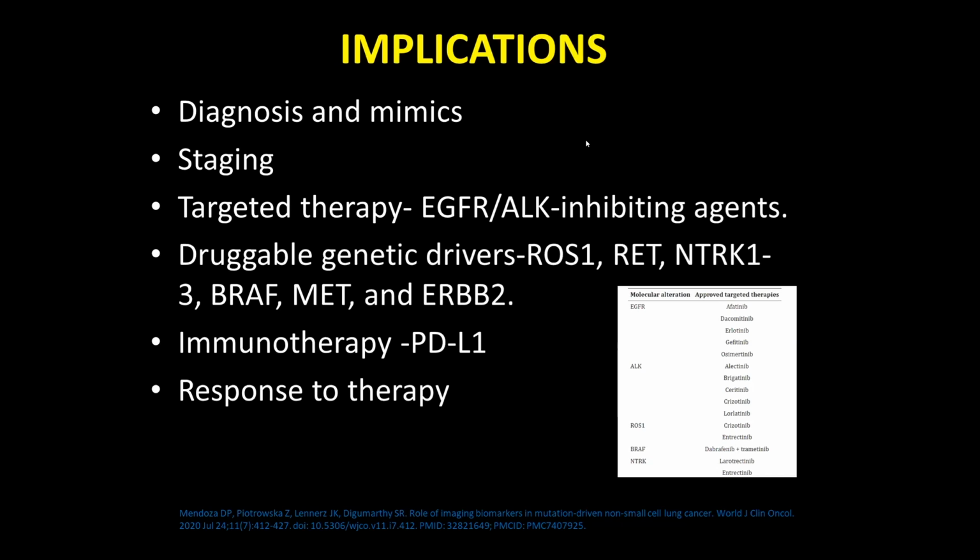Or if there are multiple solid nodules, then the T staging is based on the size of the largest lesion, and you put the number of lesions in brackets in the T staging itself. It doesn't directly become metastasis. So there are implications for staging based on the pattern. You need to know the patterns in order to stage accurately and therefore guide therapy.